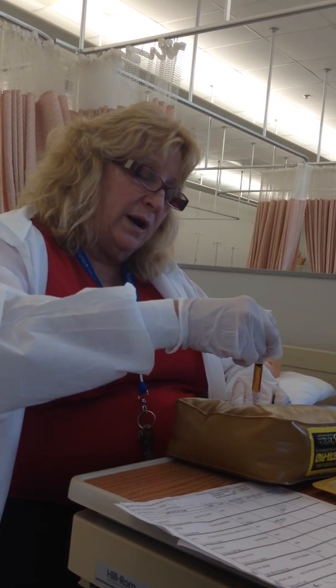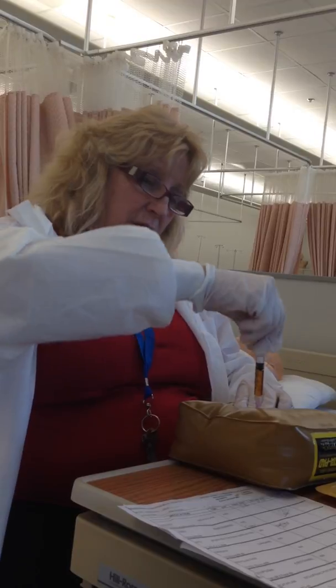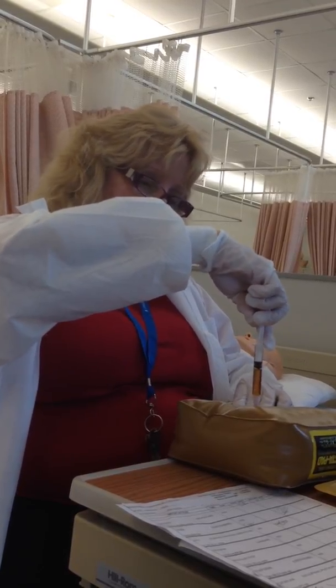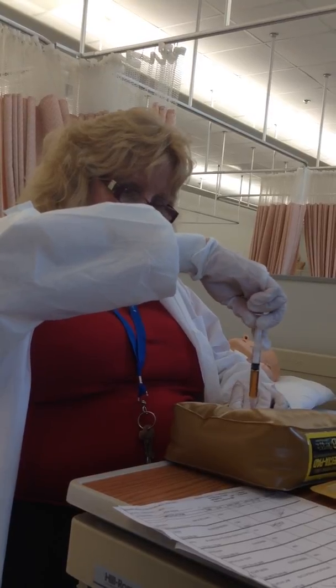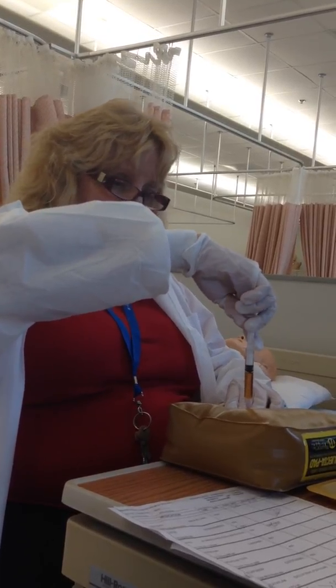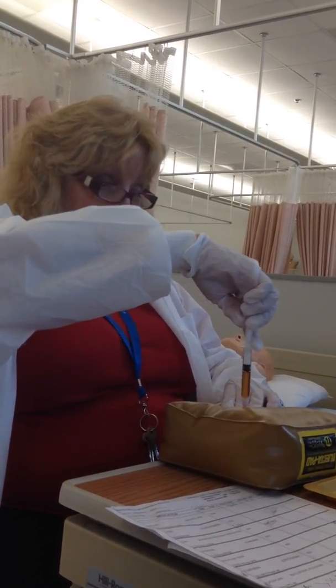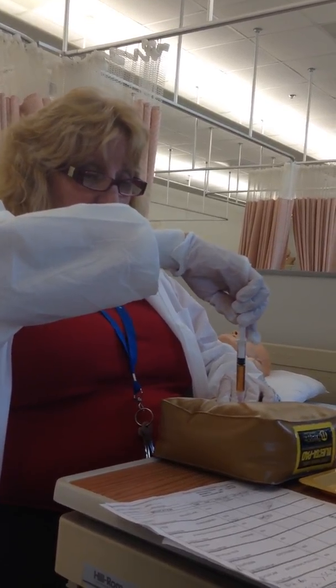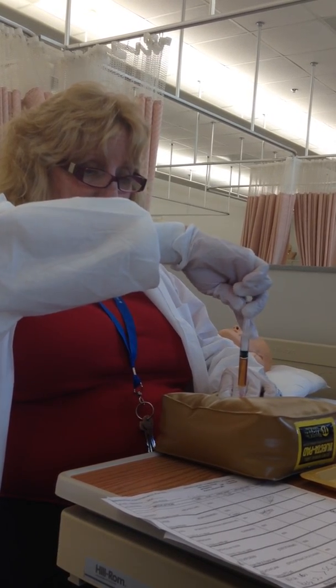And then it's a one-handed technique. So you don't aspirate like that. You go like this. Okay, and notice how when I aspirate, it goes back. It's like a suction. So you're not really drawing anything into the syringe. You're just making sure you're not in a vessel. If you were in a vessel, blood would flush up into the syringe here, but that didn't happen.